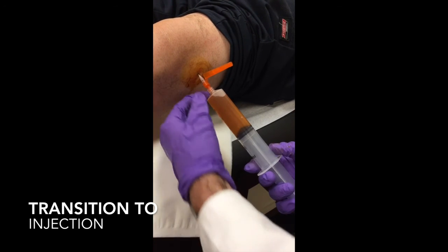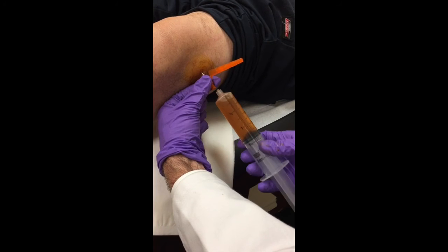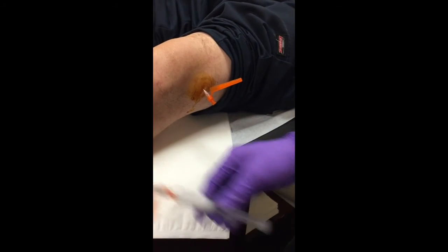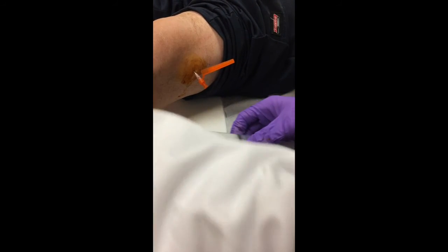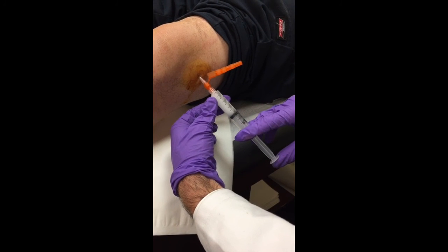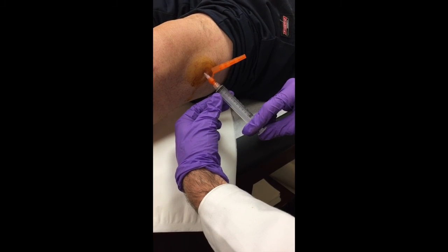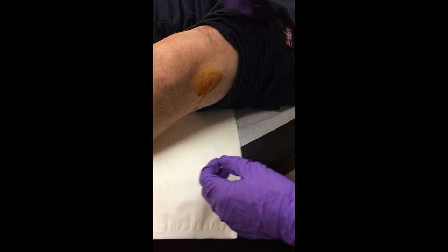Now we dislodge, holding the orange safety cap, and unscrew. Set this down — we have our cortisone injection already shaken up. Take this off, modularly hook this back up, place it down nice and tight, push the medication in, and you're done. That's it.